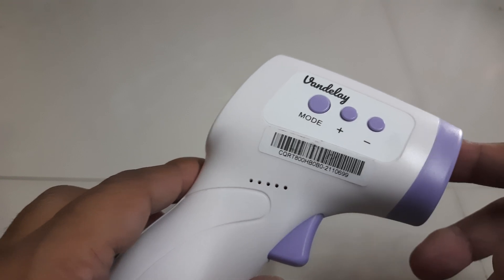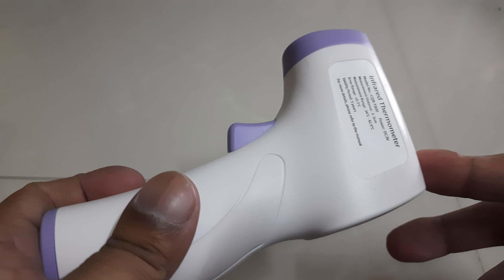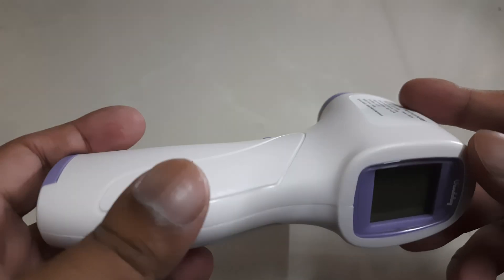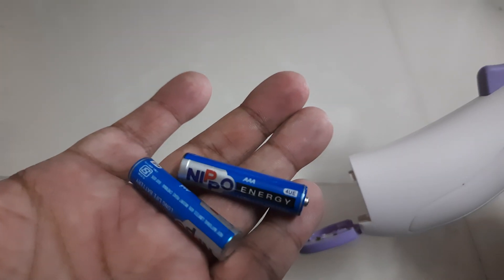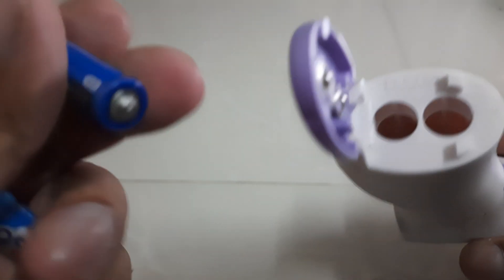I got it from Amazon for around 1250 rupees. The box was well packed and I did not find any damage. It was a company-sealed box with two triple-A batteries included.